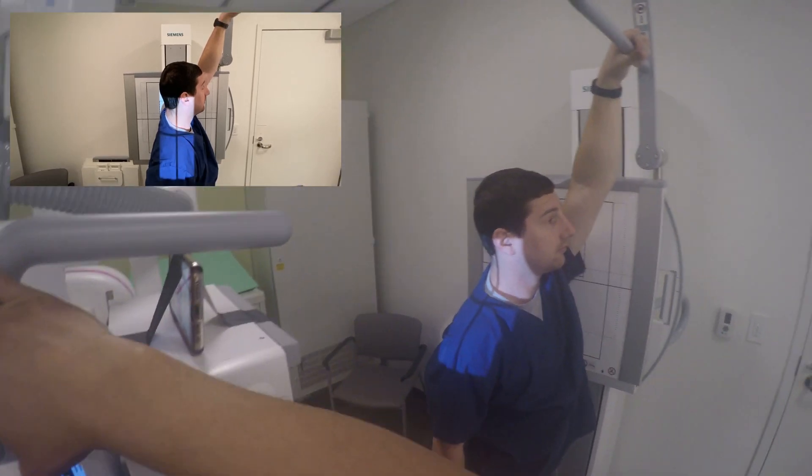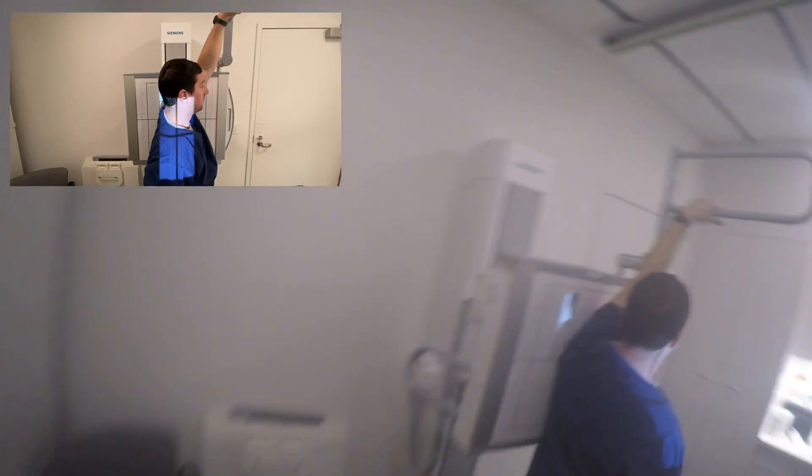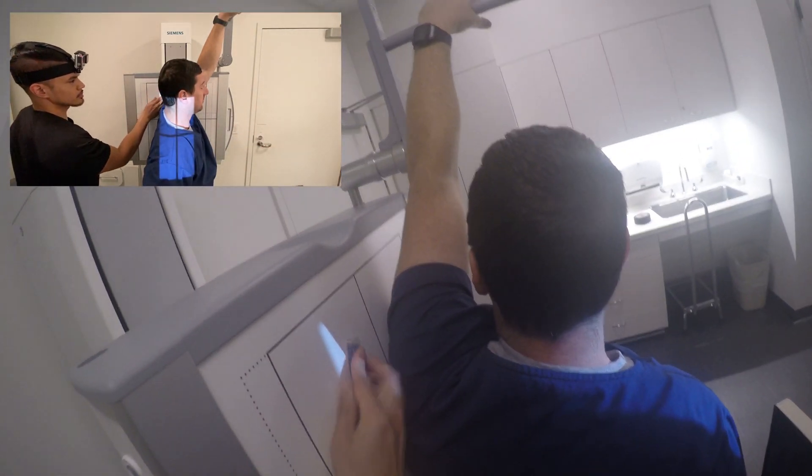One, two, three, four, five, six, seven, eight, nine, ten. Okay, all right.